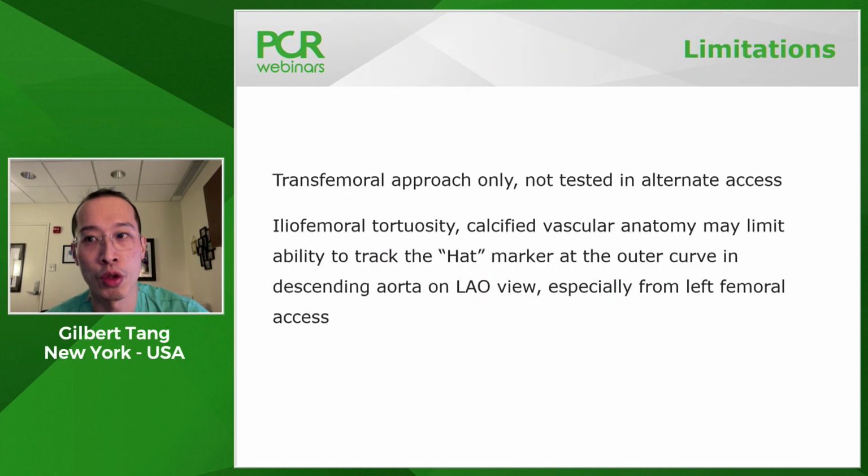So there are potential limitations with this technique. This is only a transfemoral approach. It hasn't been tested in alternative access. Our alternative access rate is well less than 3%, so it's really unusual to require that.